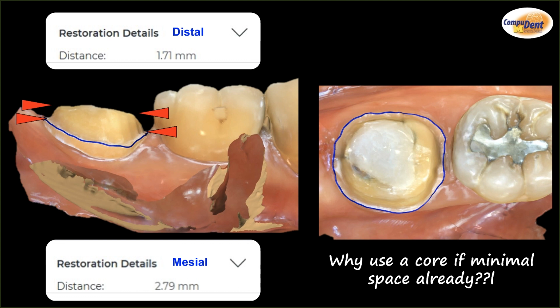Well, getting a bond to an already cured and prepped composite, there's no reactive agent there. You're going to get just some roughness that you're going to get the cement to lock into. The better bond is to the prepped tooth surface, especially if you're doing it at the same appointment you're cutting the prep, which we do with the chairside system. So there's no reason to put that composite in there. Take advantage of whatever geometry is in that part of the tooth. You have a short tooth already. Remember, we talked about you could do some geometric aspect, put in some grooves, take advantage of the whole geometric piece that was the restoration. Let those walls work for you as well. Plus, take the advantage that you're bonding to the tooth surface, not the composite.